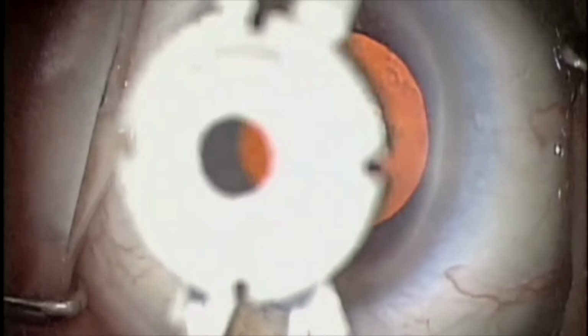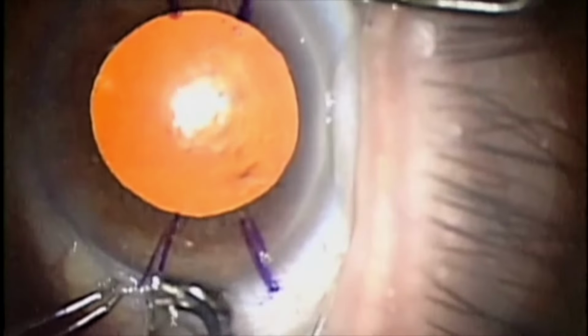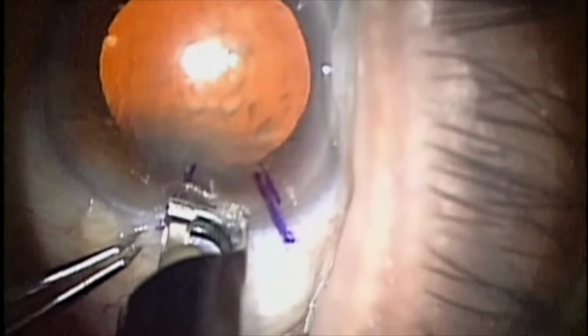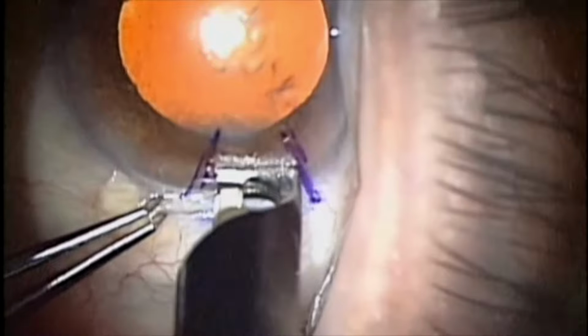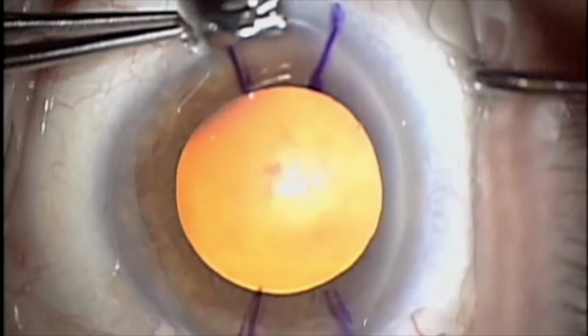After marking the marker with a gentian violet pen, I will then place it on the cornea, making sure I use my reference marks to properly place the axis for which the marks will be used. Next, I will use my adjustable diamond blade to place my LRIs. It's important to first press down, let the cornea relax, as you can see here, and then move the LRI blade from one mark to the next, observing the curvature of the limbus. This is then repeated for the other side.